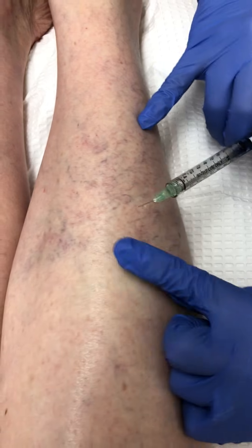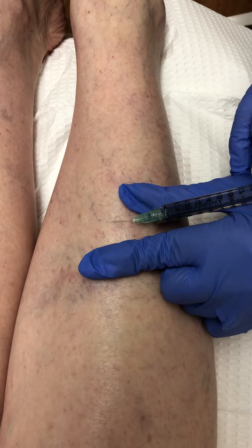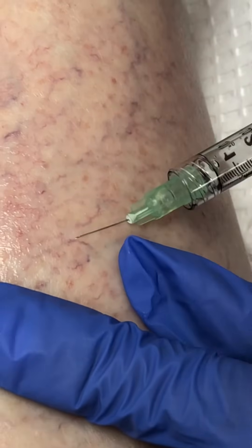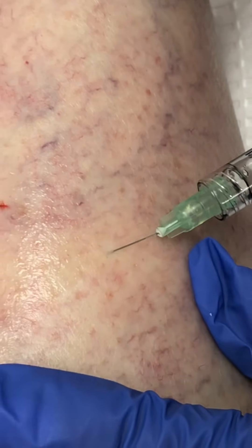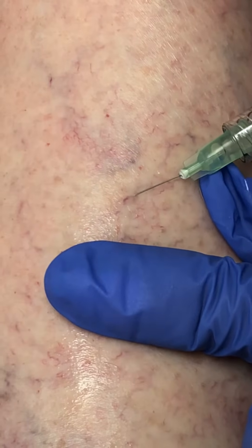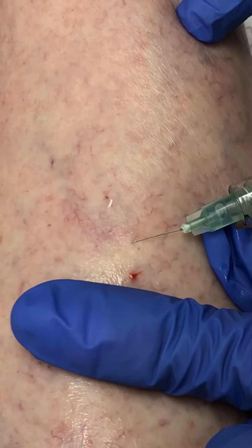So let's go ahead and inject. Leslie, let's see if we can get into this vein here. There we go — you can see it blanching right away. Look at those vessels go. Is it uncomfortable, Leslie? No, not at all. I love doing Asclera because it's immediate gratification, and you can see how effective we are at getting into the vessel with this very fine 32-gauge needle.